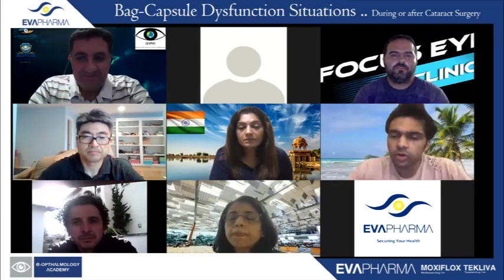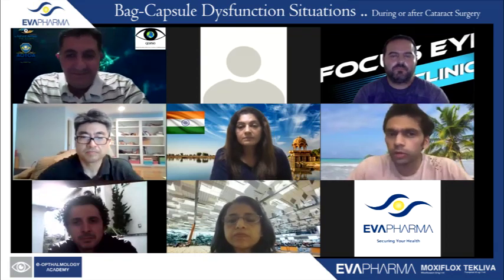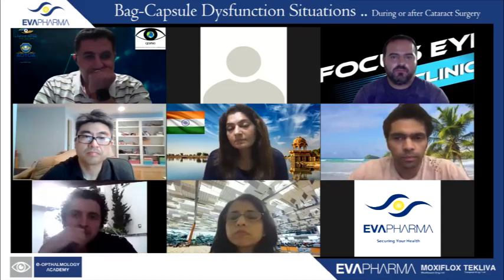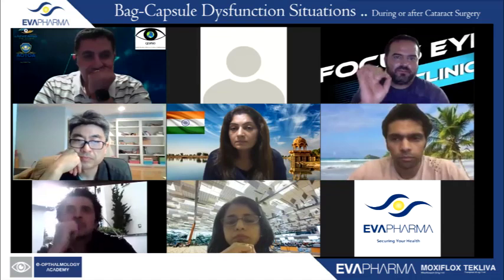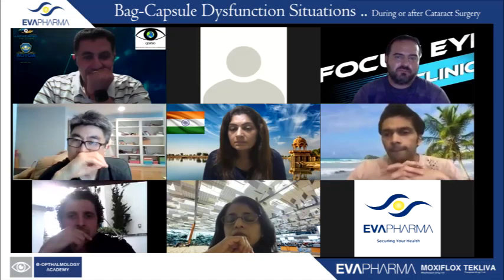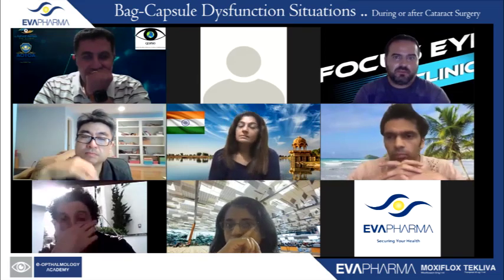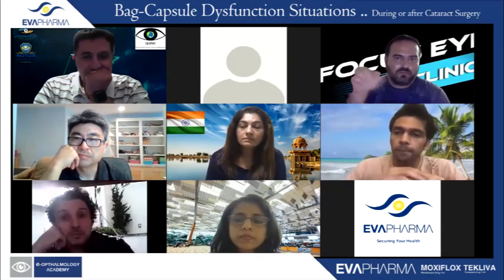Lukan, there's a question for you. What about the slit shape of the pupil once you finish the iris fixation? That happens, but what do you do with that and do you correct it? As I pointed, I don't tie the knots before. I can pull the edges of the pupil to restore the oval shape. I agree that sometimes you can end up with a cat-shaped pupil, of course, but in time you develop a fashion to round the pupil.